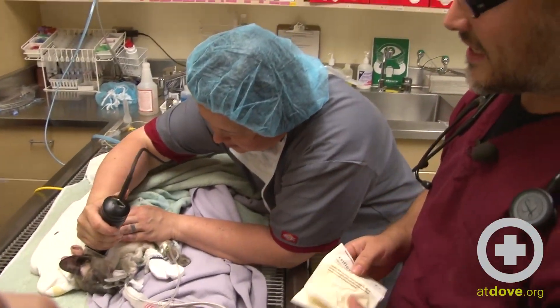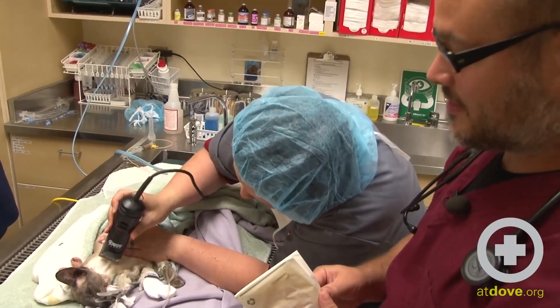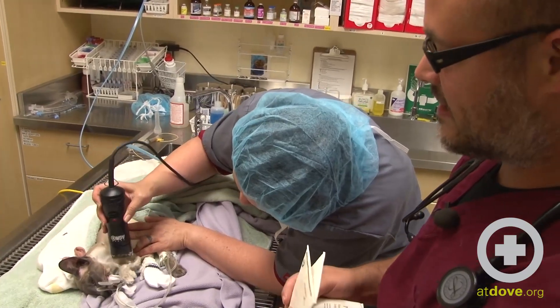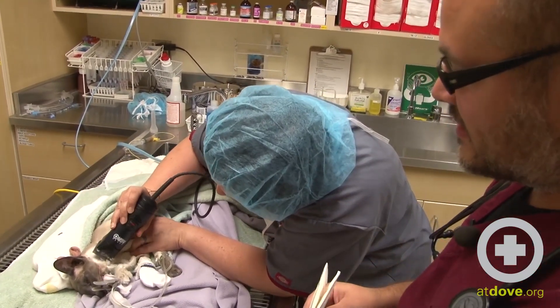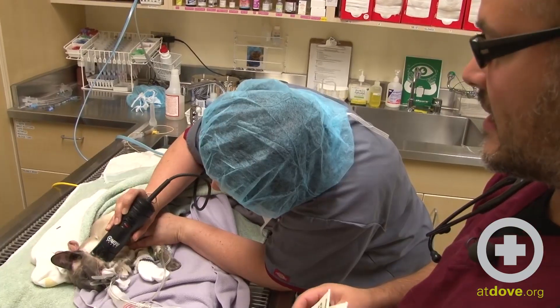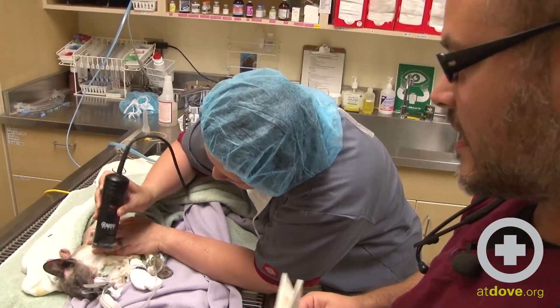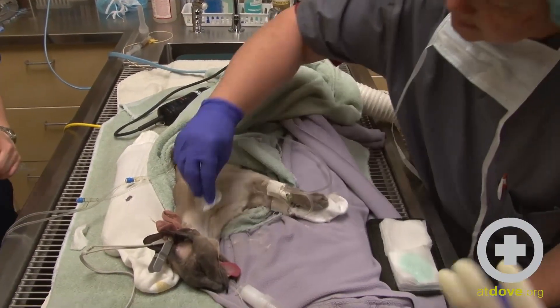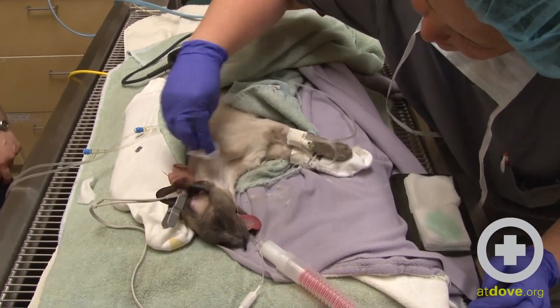We have the patient positioned in right lateral recumbency to have the left side of the neck facing up. This is the side we use as we usually want to place the esophagostomy tube on the left-hand side through the esophagus. We are now prepping the site with some surgical scrub.